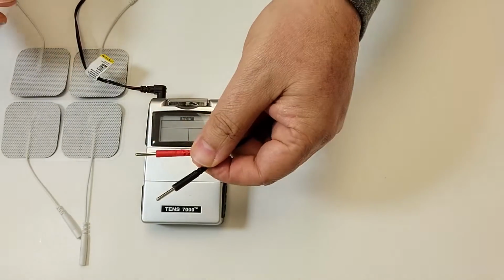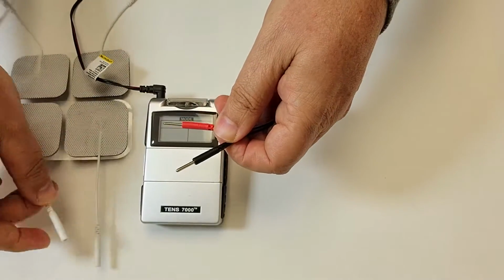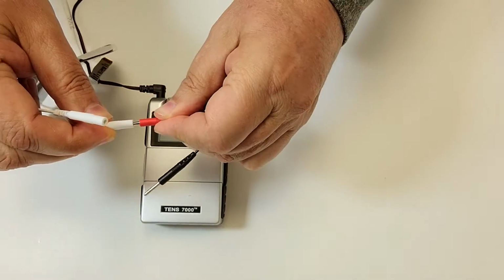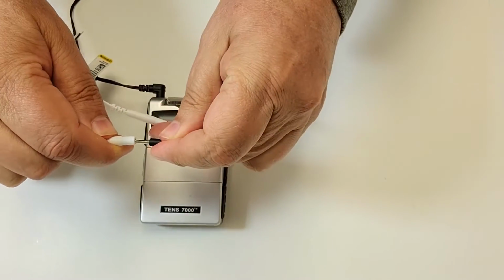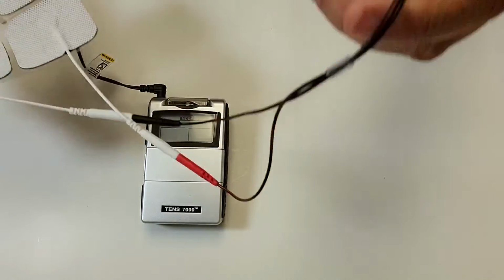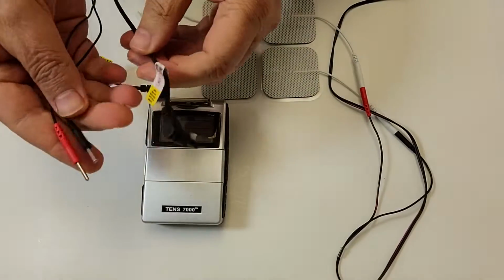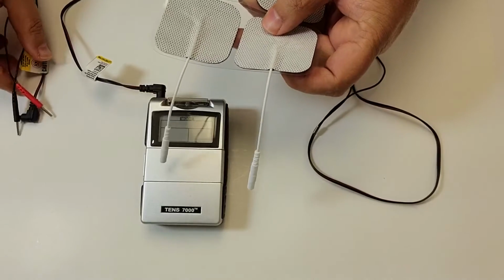Once I plug that in, you have the 2 ends here, the black end and the red end. Now find your electrodes, and to install the electrodes, simply push the 2 together. To use a 1-channel setup, you will use 2 electrodes. To use a 2-channel setup, you will have to grab your other set of lead wires and plug those in to your electrodes.